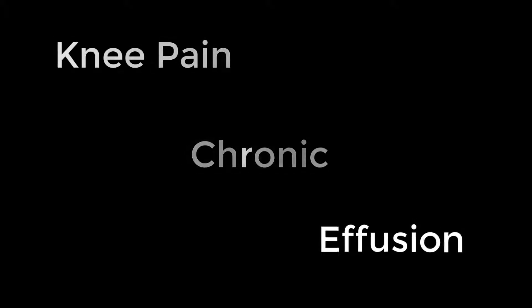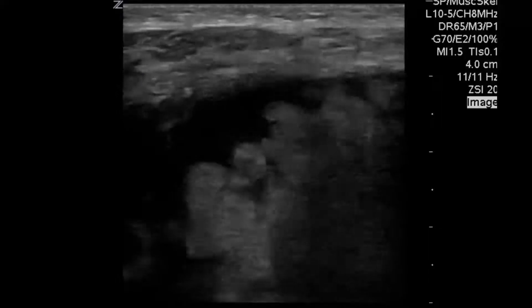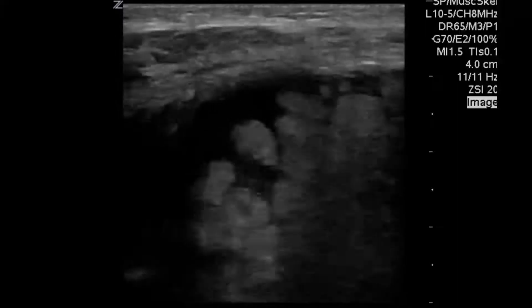The medical student wanted to ultrasound, as the patient had an effusion on exam. We wanted to see what that looked like. And when we placed the probe on, we certainly saw an effusion. But when we saw all this extra stuff, it looked like a bunch of seaweed floating in an ocean of effusion.